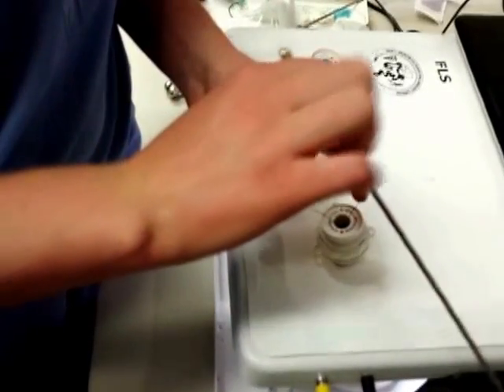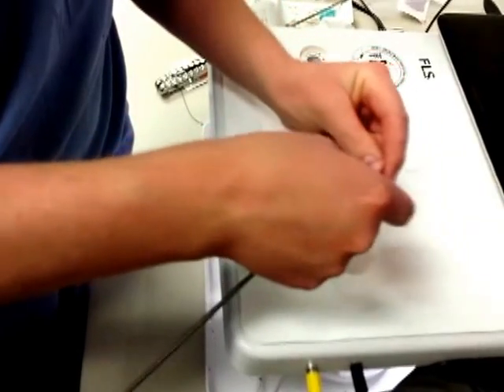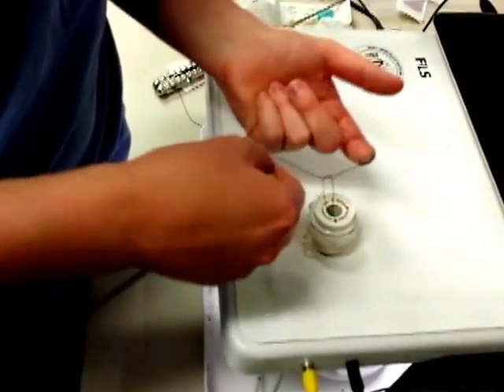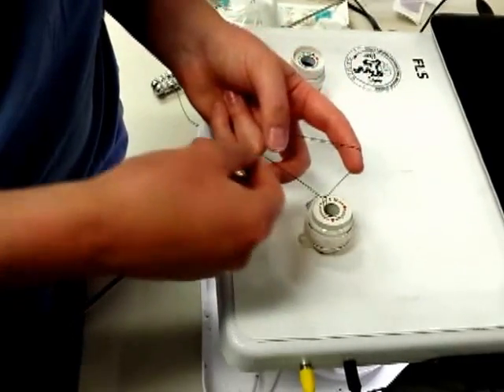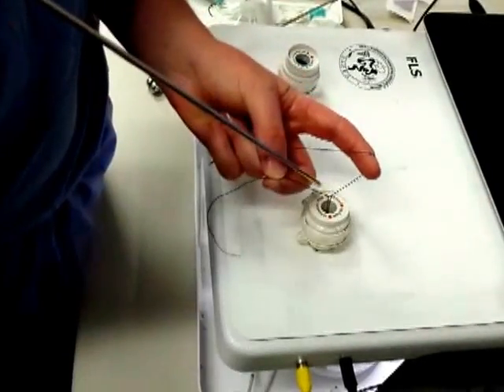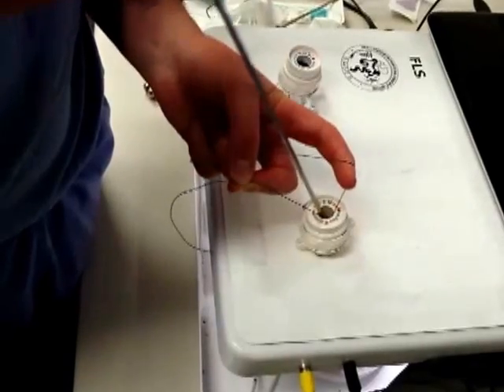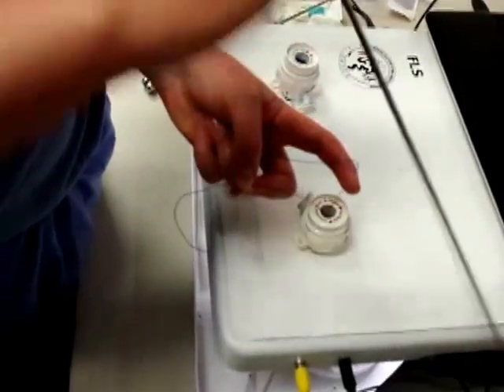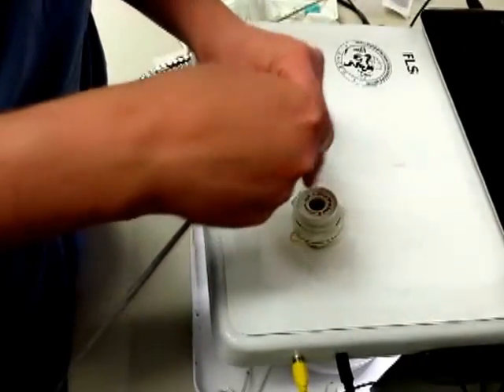Once the knot pusher is removed, simply palm the knot pusher and perform another two-handed throw. Place the suture with the needle attached over the index finger, and the free end between the thumb and ring finger, spreading the sutures apart. Rest the knot pusher on the thumbnail, onto the suture material, and down onto the target. Once again, palm the knot pusher so you don't have to search for it when you're ready to use it again.